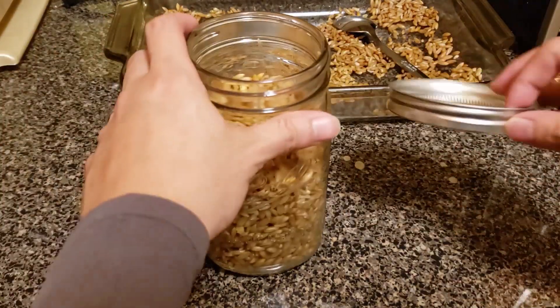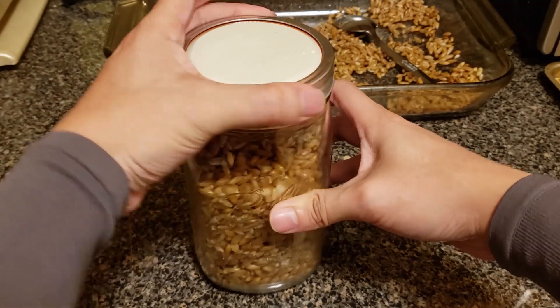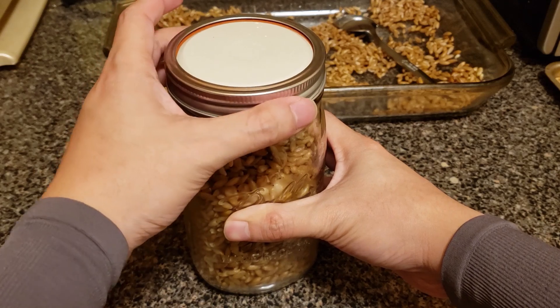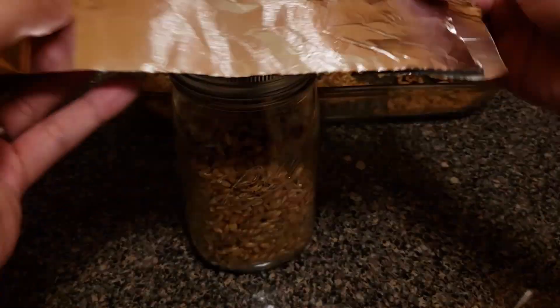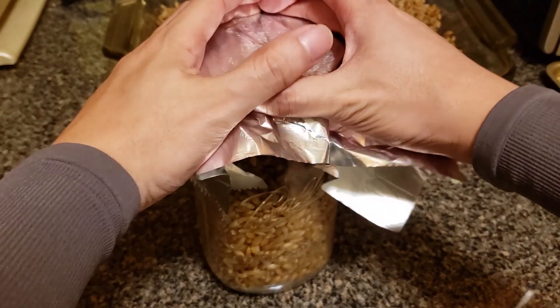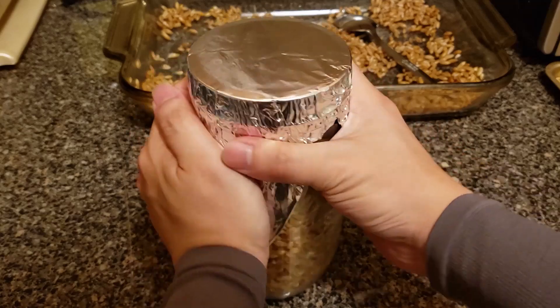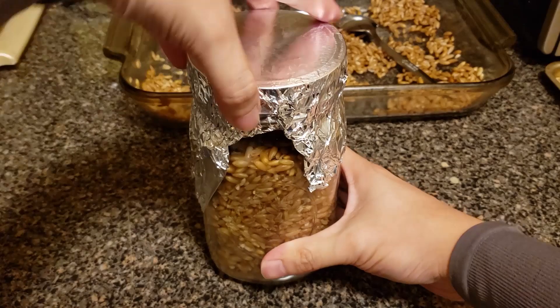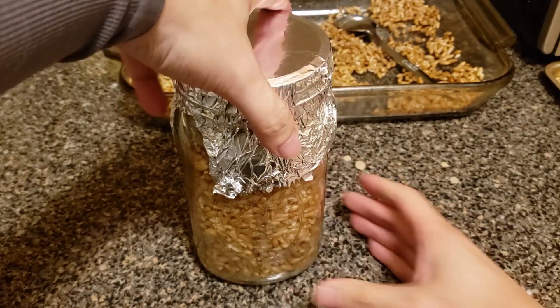Now that the jars are filled, put the lid on. I'm doing my unmodified lid setup here — I'll flip the lid over on top of the jar, screw on the ring, then unscrew it about a quarter or an eighth of a turn so the cap is loose. Cover the lid with aluminum foil to prevent condensation from falling on top during pressure cooking. Double-check that the lid is still a bit loose, then we're good to load them into the pressure cooker.